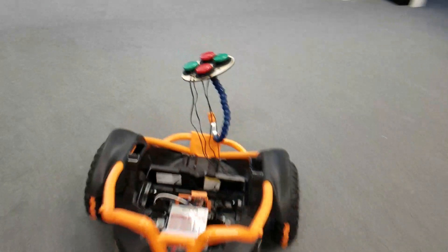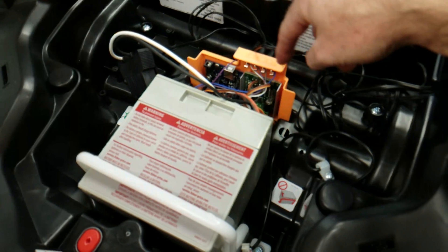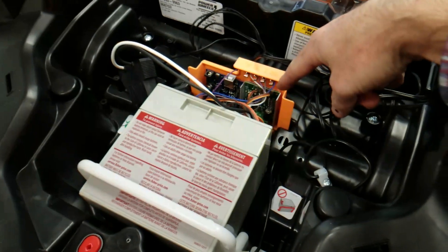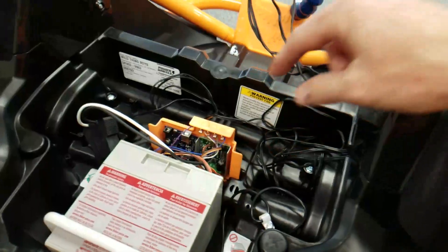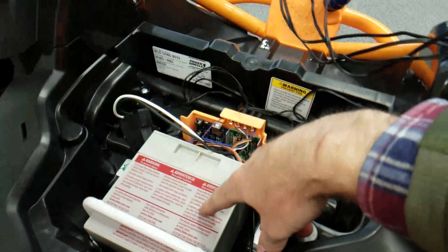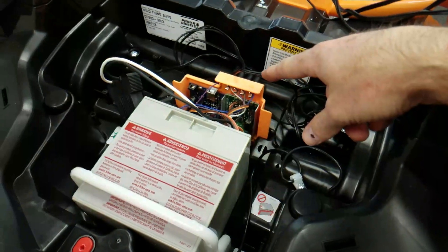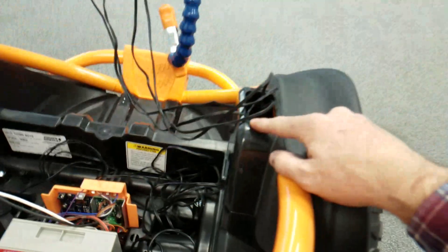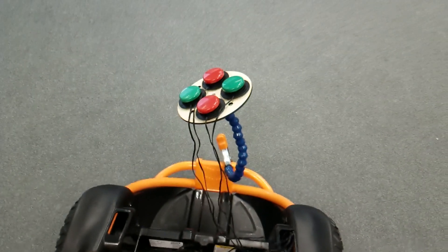Here's the modified unit. It has an Arduino Uno in it as well as a Sabertooth 2x12 motor controller, and that connects directly to the stock battery. We run the switches — labeled and routed up through the port where the joysticks used to come out — up to our little jelly bean array up here.